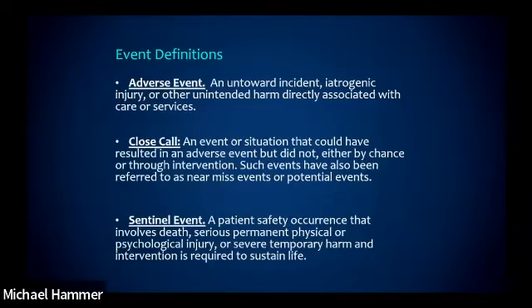So it's a close call. Another term is a near miss. There are other words out there that people use, but it's an event or situation that could have resulted, really close, could have resulted in an adverse event, but did not, either by chance, like we just got lucky, or by intervention. I caught myself. Let's get those anti-tip bars back in place. Such events have also been referred to as near miss or potential events.